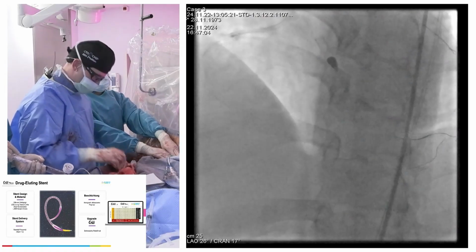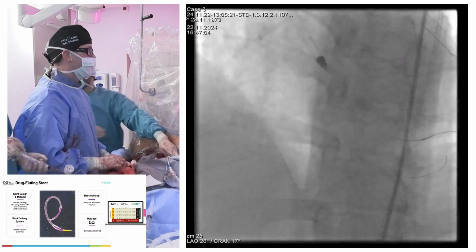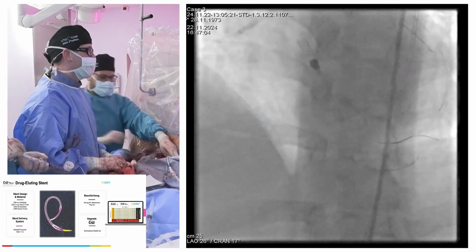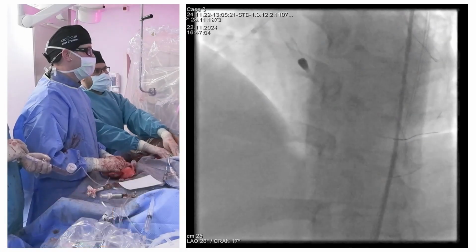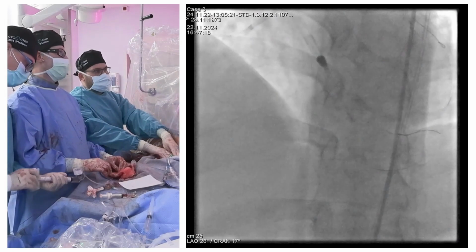You showed us that the distal stent was really underdeployed. Was it implanted in an acute coronary syndrome? I think sometimes it happens when you implant small stents in STEMI situations and you underestimate the vessel size.